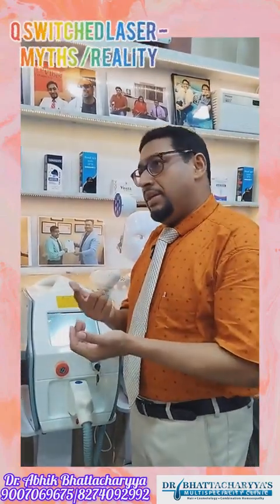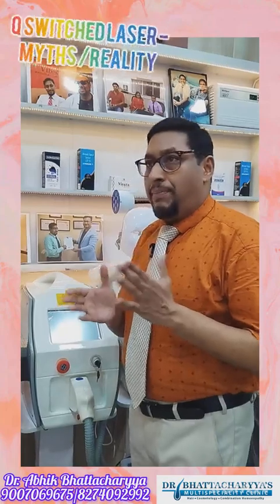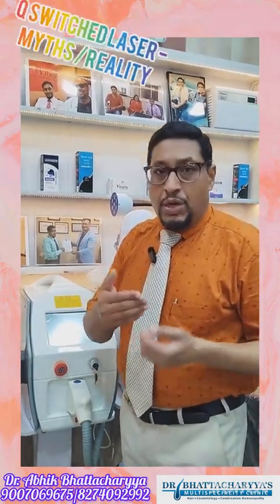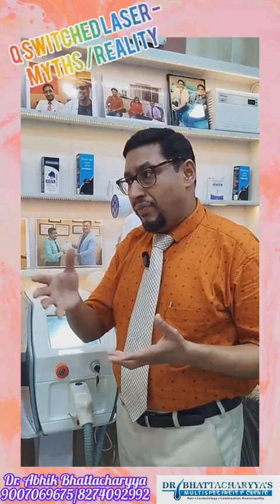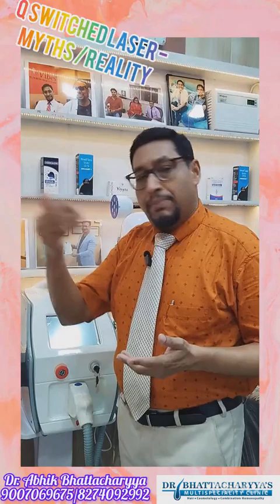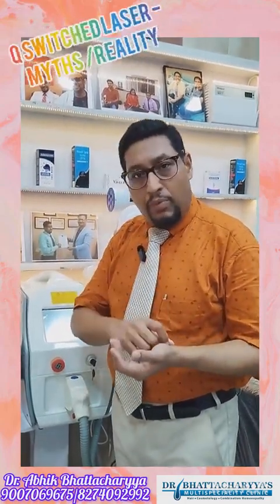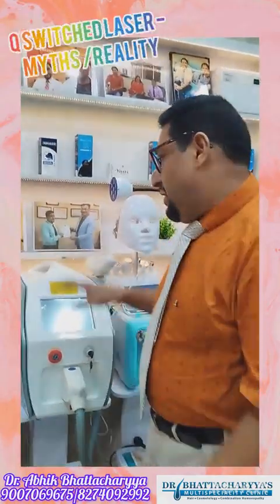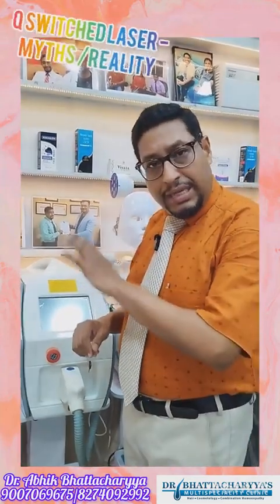This machine is basically used for tattoo removal and any pigmentary lesions, like any kind of birthmark, tattoos like black and white tattoos, and color tattoos also, professional ones. Black and white tattoos are also of two different kinds: one is amateur tattoos, which can be done at any fair or in the suburbs, and the other is professional black and white tattoos. Every tattoo can be removed by this machine. So basically tattoo or any pigmentary lesion can be treated.